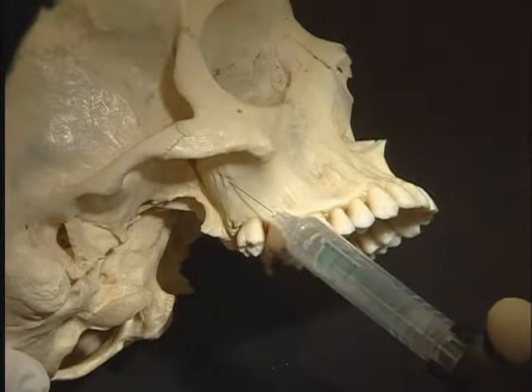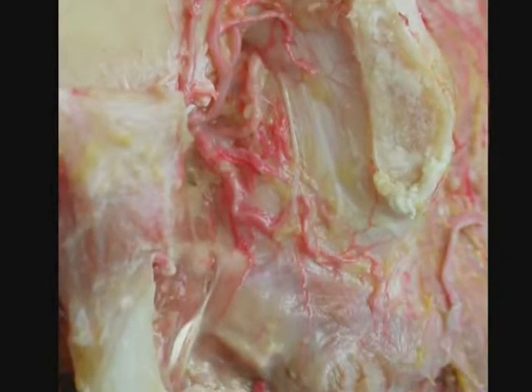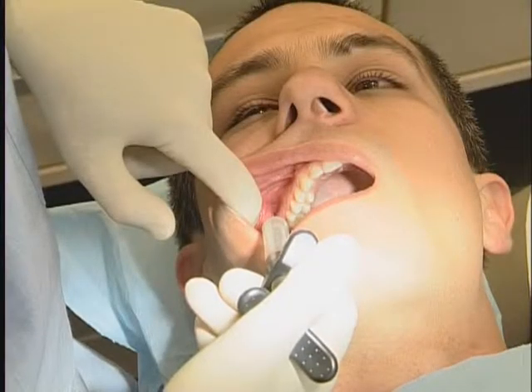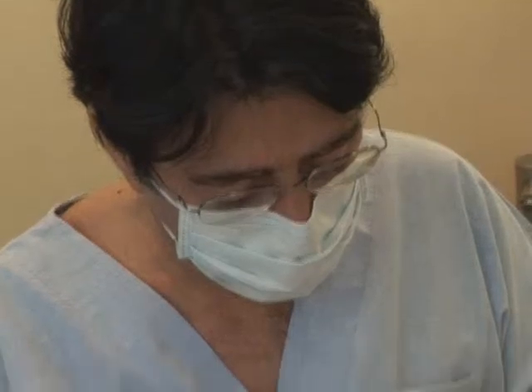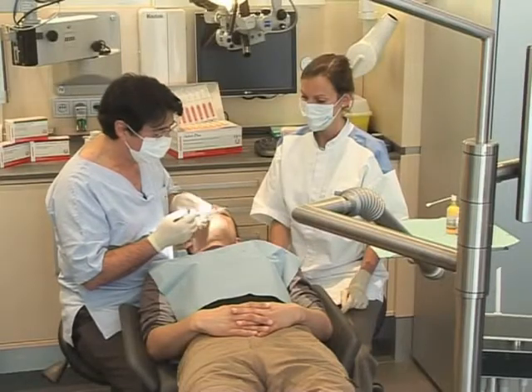The syringe is oriented at an oblique angle of 45 degrees to the plane of occlusion and 45 degrees to the bone surface plane. This will avoid damaging the extraosseous branch of the posterior superior alveolar artery located under the periosteum. Penetration depth of the needle must relate to the height of the maxilla, which is, on average, 15 millimeters. You must aspirate after delivery of each quarter of the cartridge in this region.